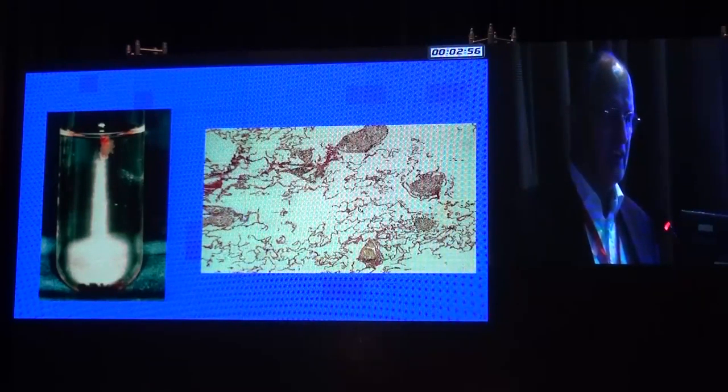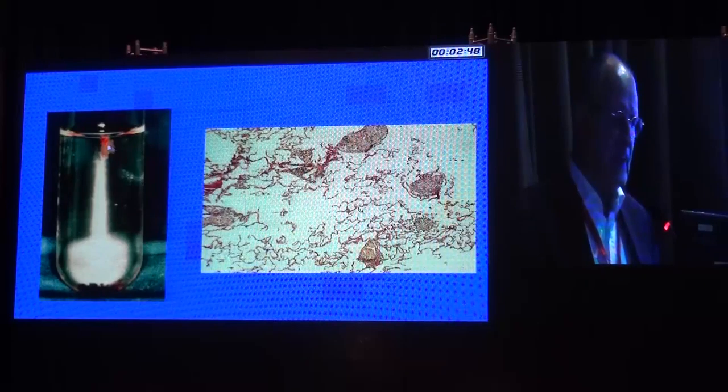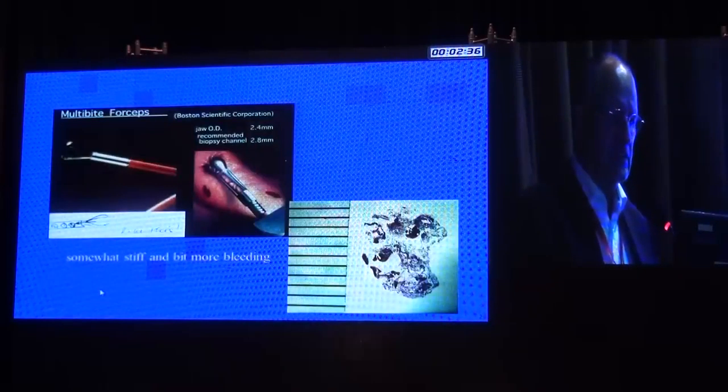So you see the size of tissues up to 400 alveoli. These are granulomas in sarcoidosis between alveoli. If the tissue is floating, unless it's fatty tissue, you can be sure that it's lung tissue. If it's going down, it can be lung tissue with severe infiltration, but not necessarily.